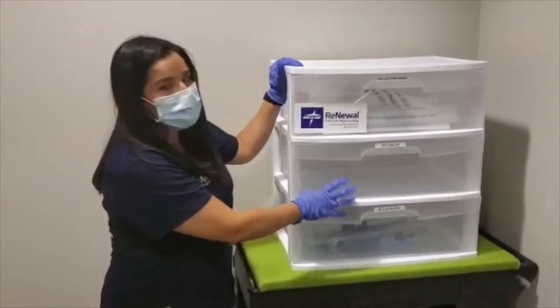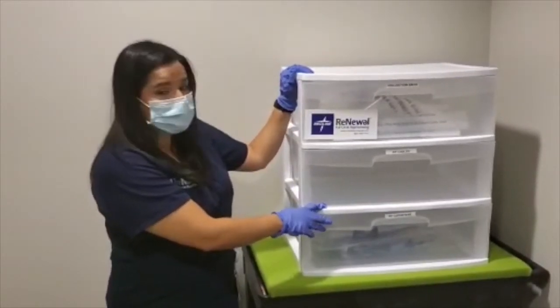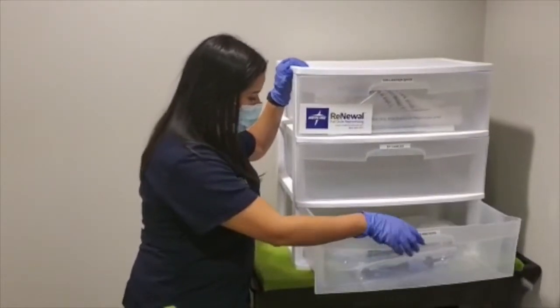Your EP catheters will be in one of the drawers. If your facility is doing EP cable collections, you want to make sure that they are kept separate and the bins are already labeled.